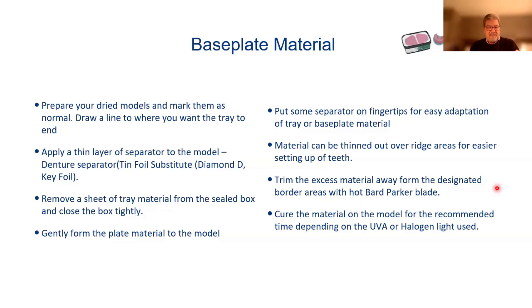Adapt it really well, because the result I want to get with the base plate is that the patient feels how the finished denture is going to feel. I want to adapt it really well, and when you're trying it in, taking an occlusal registration, and doing the denture setup, you want that to fit well.